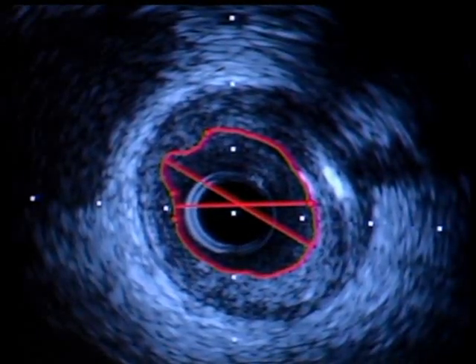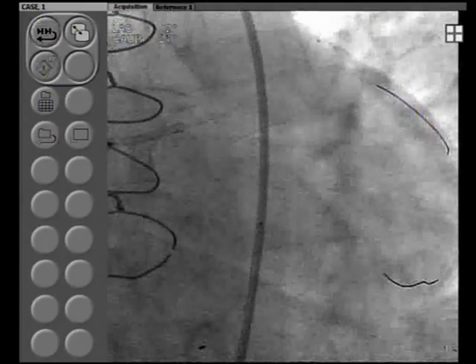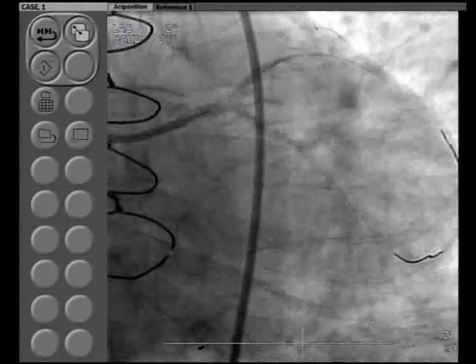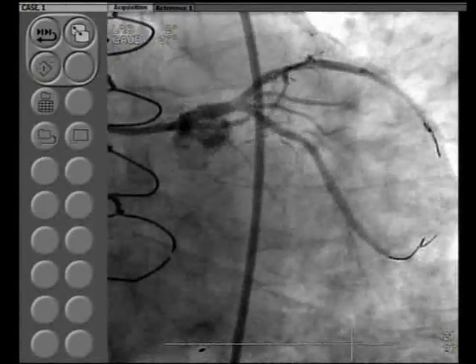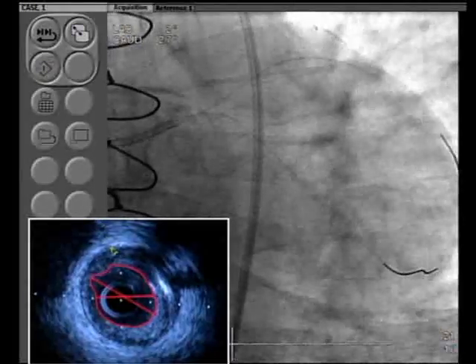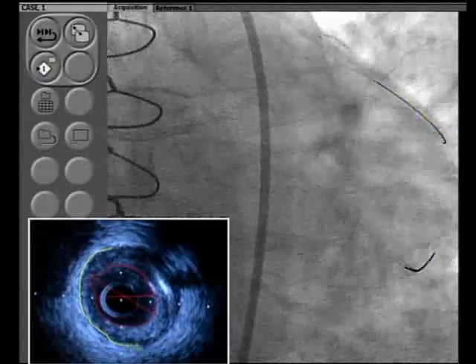Now we can go to our angiogram. This is a 3.0. We can go back. Now play this one so that we can show that area just of the circumflex. Yeah, this area. See where my IVUS was? That haziness. Is that area just at the level of the catheter? Look, I can tell you that short of IVUS, that is very easy to overlook. Therefore, whatever stent we decide on, it should cover that area.